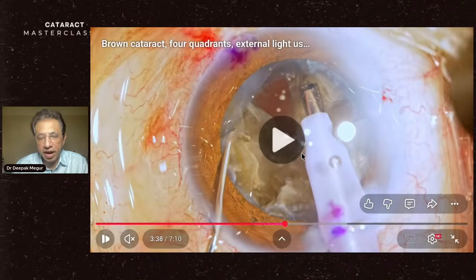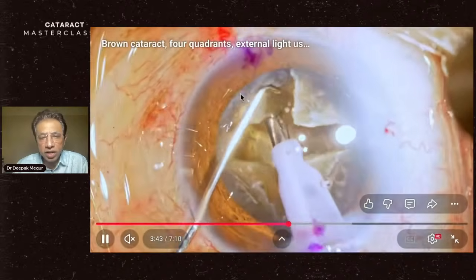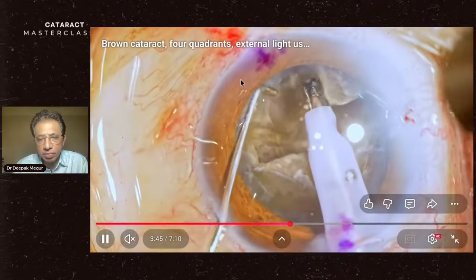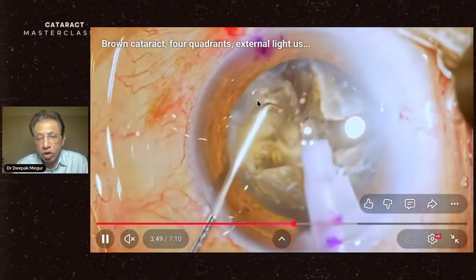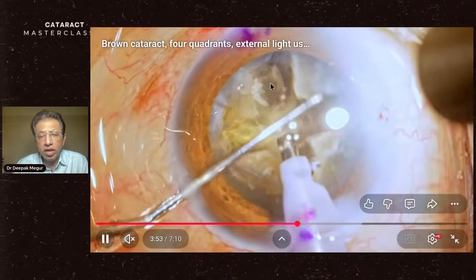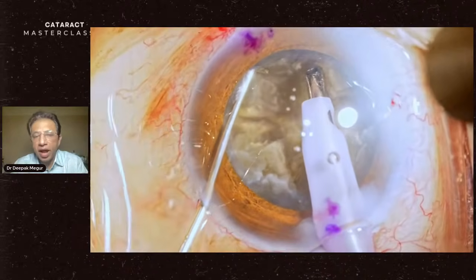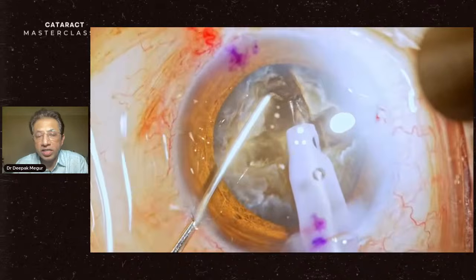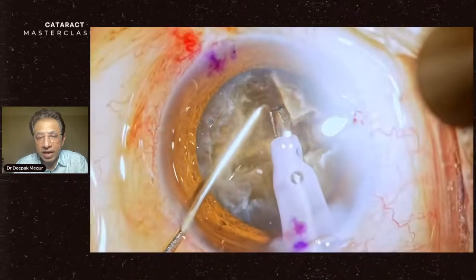It is not cracking, but nevertheless you can't stress too long, because you need to be mindful that when you do an excessive lateral separation, you are going to stress the rhexis margin as well. So you need to be very careful in the way you do it. A longer instrument would definitely help. You could go back and place it much deeper, and then it would have been much easier. So this appears to be slightly better.